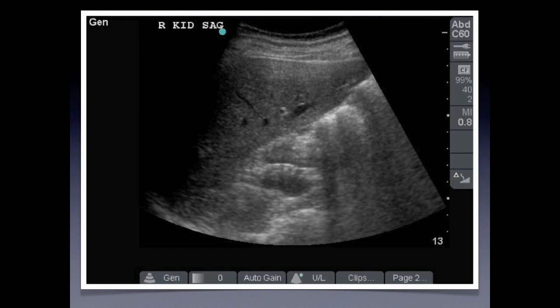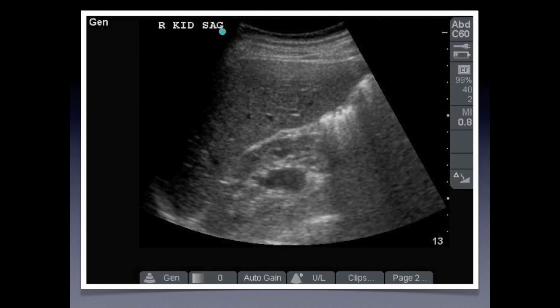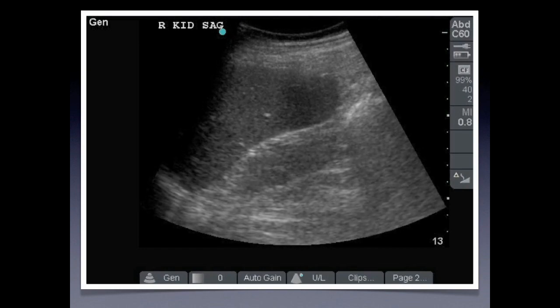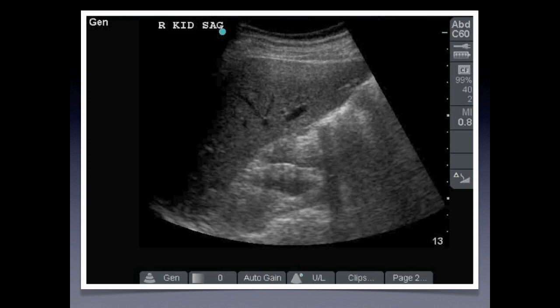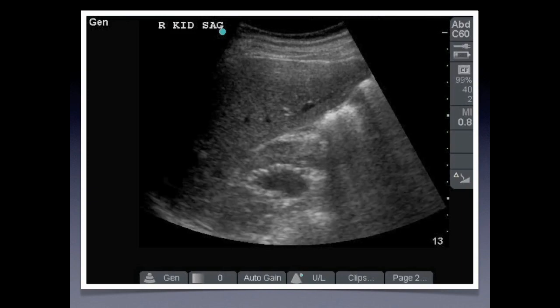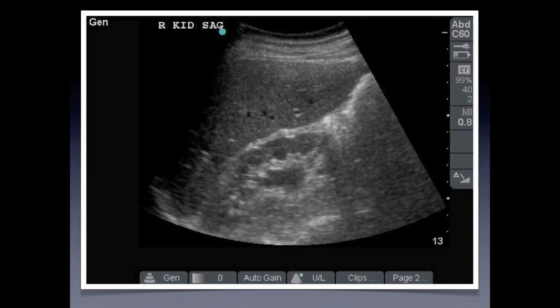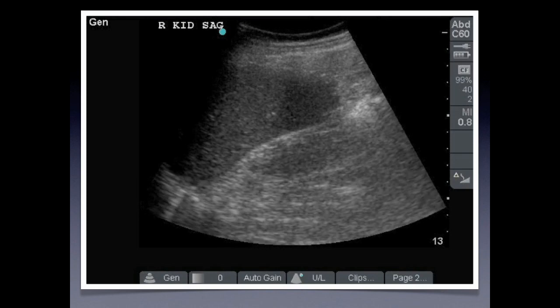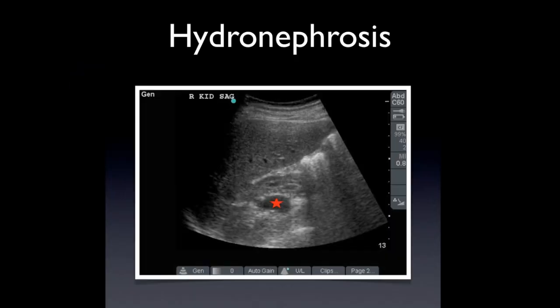Now let's sweep through this view. As you can see, there is a dilatation within the collecting system of that kidney. It's anechoic and dilated. If we freeze the image, you can see that there's definitely dilatation of the renal pelvis. This is moderate hydronephrosis.